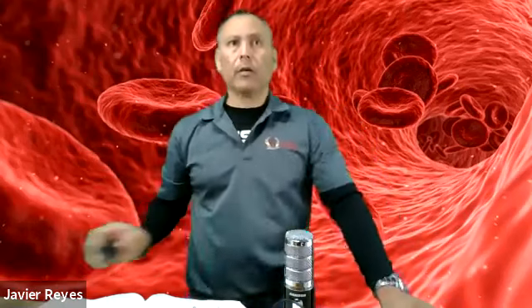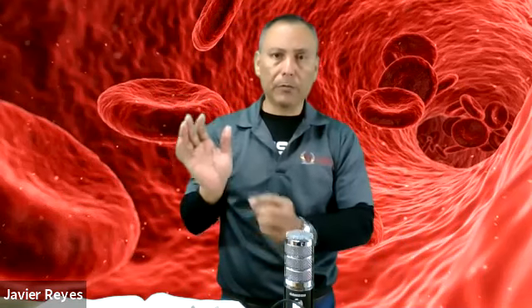Okay, so we continue our discussion here on capillary punctures. Now, capillary blood gases are not usually collected in adults. It's very rare that we actually collect them in adults because for the most part, it is pretty safe to collect arterial blood gases from an adult, usually from what we call the radial arteries. Okay, usually the respiratory therapists are in charge of this, and they're the ones to collect these kinds of specimens. So you should not be worried too much, and you should not perform this procedure unless you've been trained to do so in your facility.